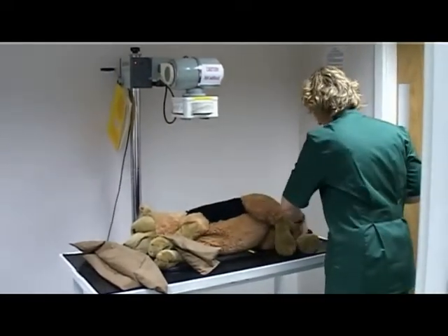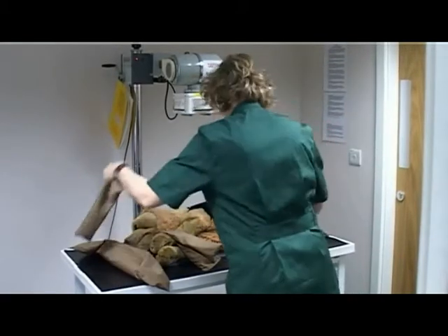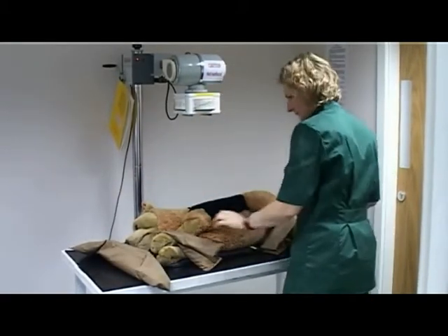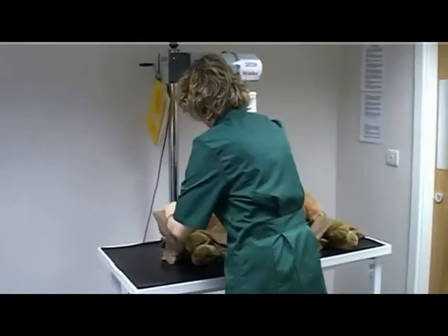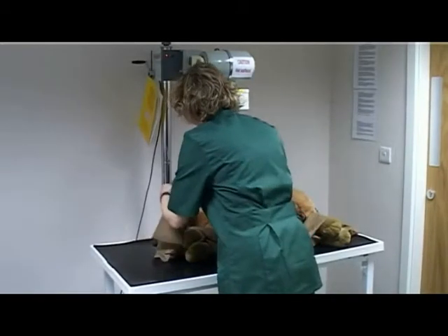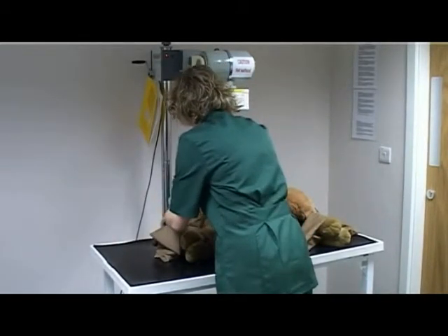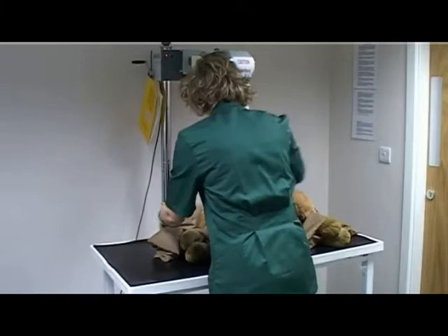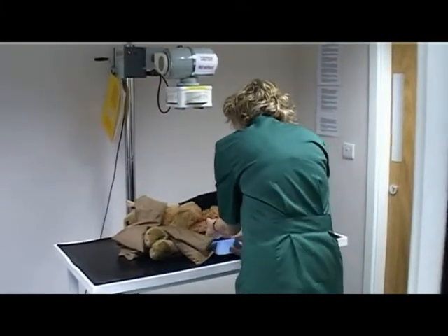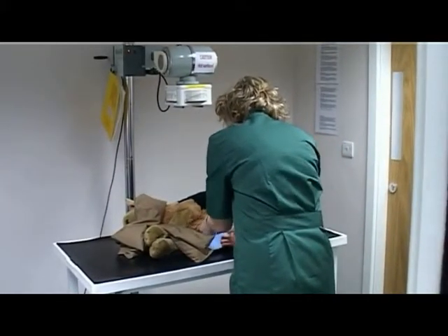Place a sandbag over each hind limb. Place a sandbag over the neck or mid-cervical region to secure the patient. Place a small foam wedge under the sternum to prevent rotation of the thorax.